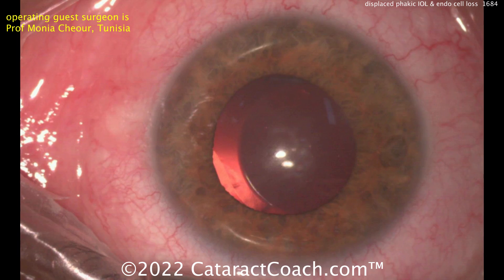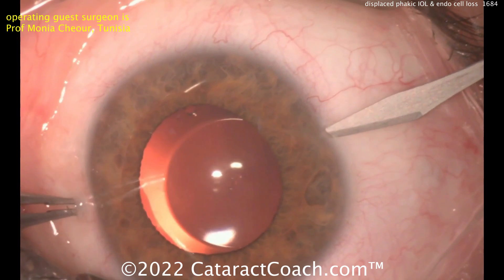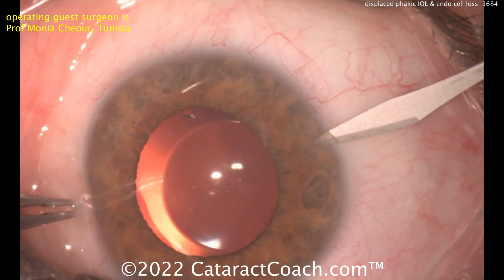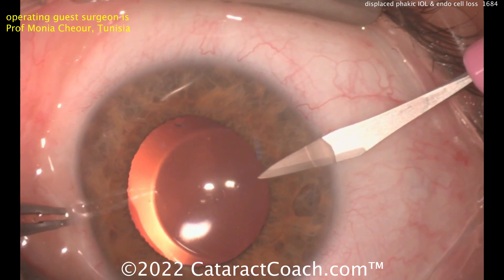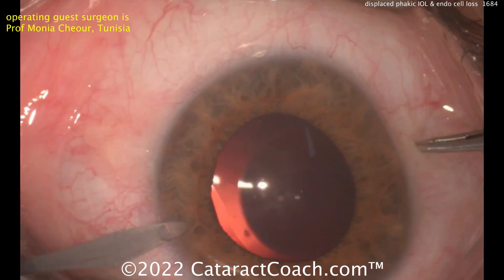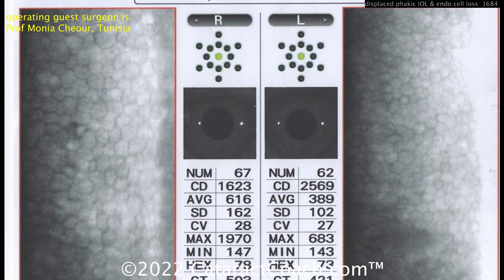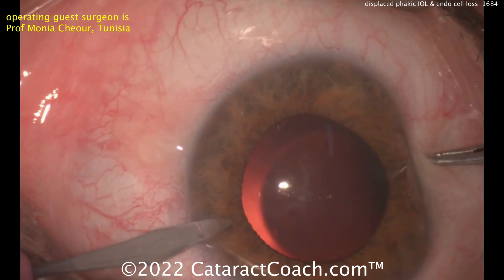Now the patient has that dislocated lens, which you saw here. You can see it's a little bit shifted. This can be due to certain sizing issues. And now a year later, the right eye is down to 1,623, whereas the left eye is still about the same at 2,500–2,600. So really lost a lot of endothelial cells on that right eye.